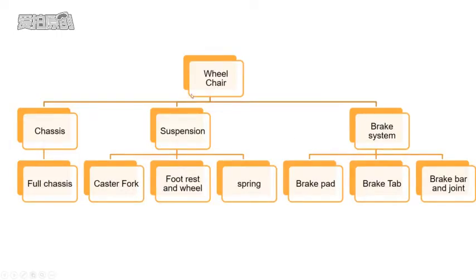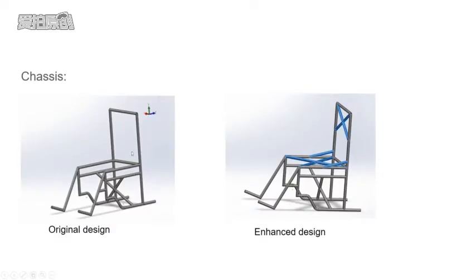And here you can see the chart we just divided into three separate systems, and the systems below are based on these three main systems. Here are the pictures of the chassis, the original design and the enhanced design.